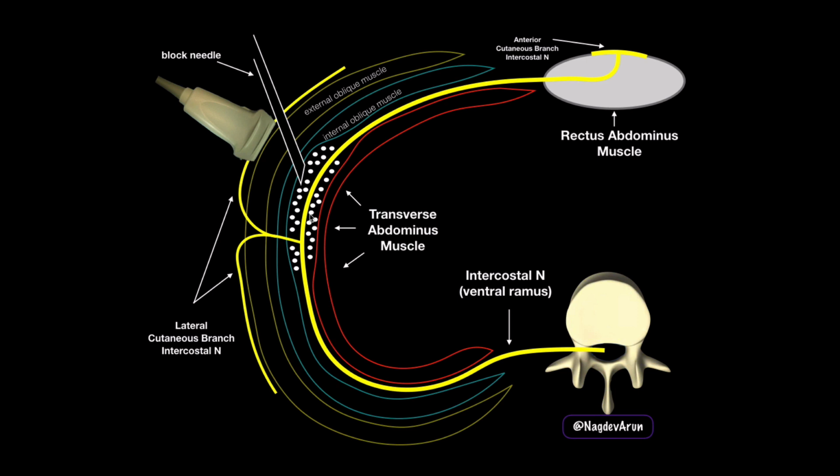I remember Rob was just starting the fellowship. He'd never done one, and I walked him over, and it was not too difficult of a block, was it? No, I think this is actually a pretty safe block. Given that we're doing a similar kind of viewing for assessing for ascites or even for paracentesis, I think it's a view that a lot of physicians are going to be very comfortable with. And once you identify the musculature planes, I think it's an easy block to adopt.